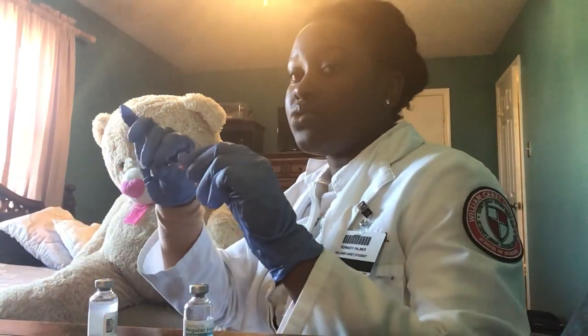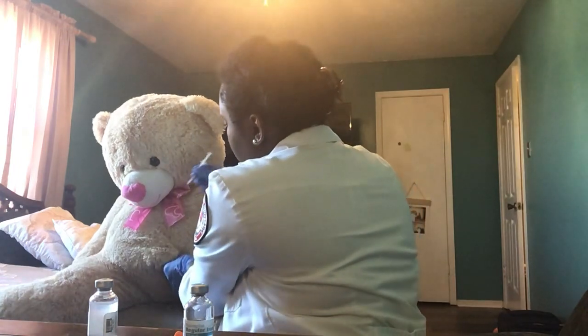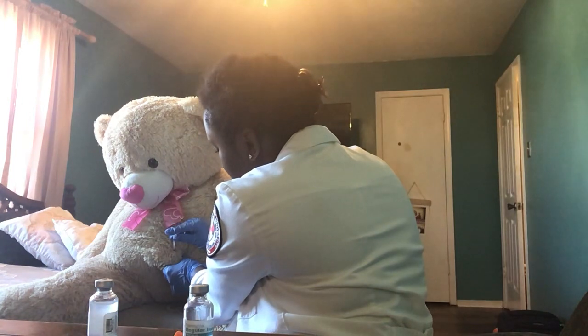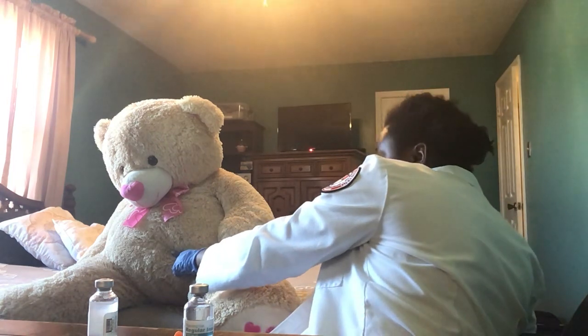I'm now going to remove my cap. I'm going to squeeze 2 inches of skin, and I'm going to inject at a 90-degree angle. Give the medication. Okay, and after giving the medication, I'm going to get an alcohol swab and apply pressure. I'm going to dispose of this in the biohazard bag or in the sharps bin.